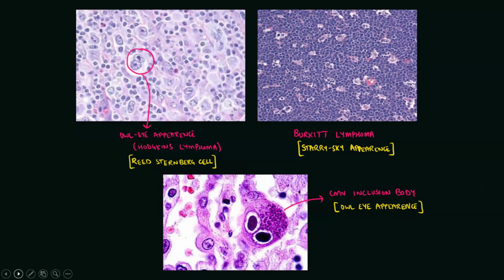So basically what happens is tumor cells are medium sized, and they are round. They have very minimal cytoplasm. Because of this, they are very close to each other, and because of the closeness and minimal cytoplasm, they give a blue background that is known as starry sky appearance.